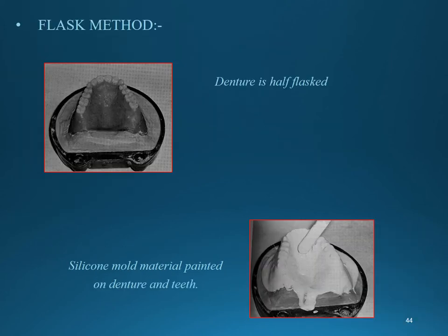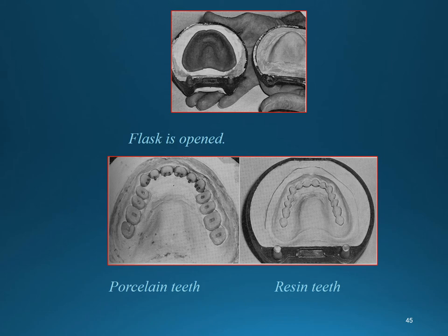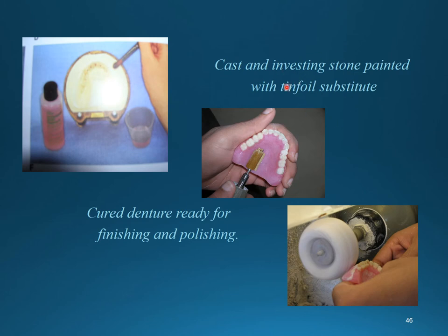In the flask method (laboratory method), the denture is half-flasked and silicone mold material is painted on the denture and teeth. The flask is opened; the denture base is on one member and the impression on the other. Separating medium is painted on the cast and investing stone, the resin is packed, and the denture is cured and ready for finishing and polishing.